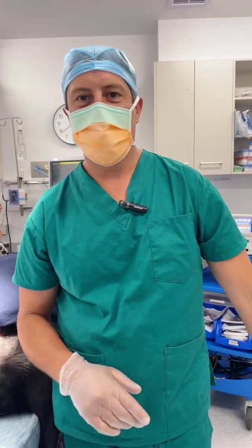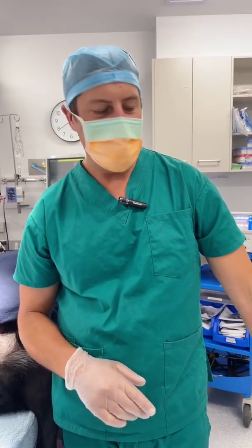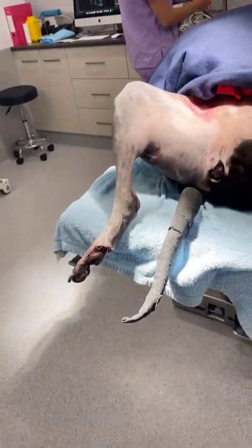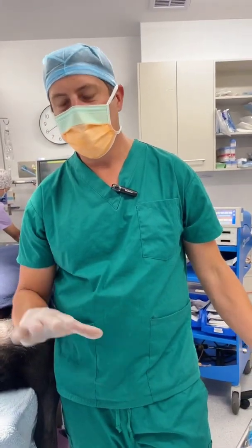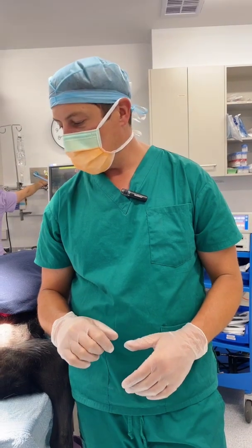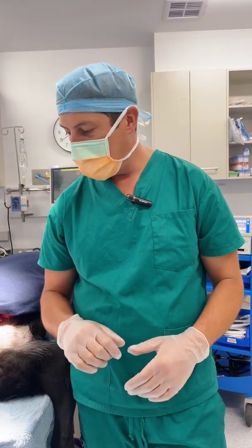G'day guys, Dr. James Simcock here from Vet Dojo. We've just done a digit amputation, a partial foot amputation on this dog. I'm just gonna do a quick video to run through the bandage that I use for bandaging around the foot. I find it gives an extra bit of padding and works quite effectively for these types of situations.